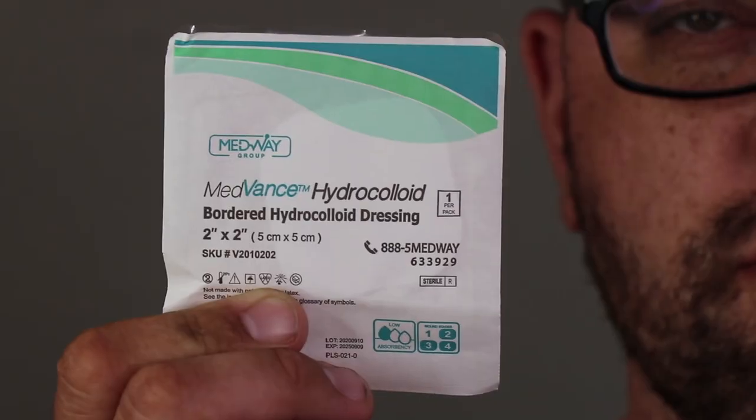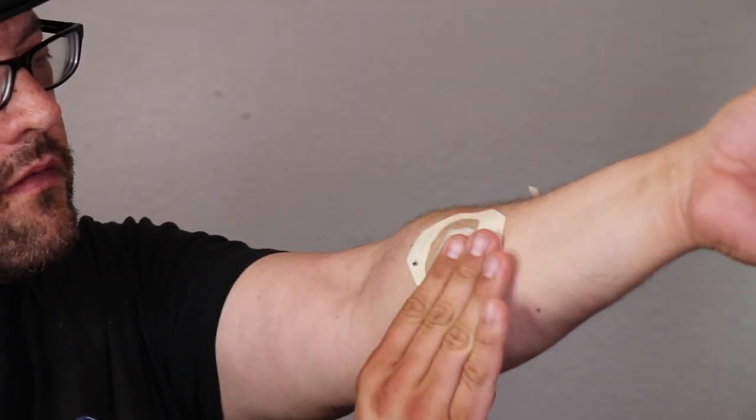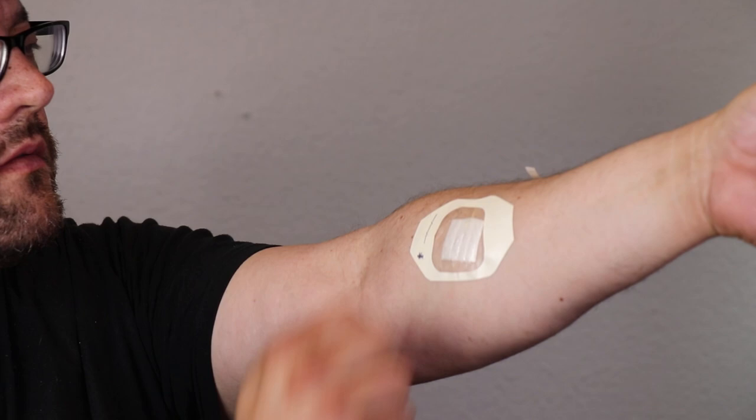The next item is a MedVance 2x2 bordered hydrocolloid dressing. It has a cohesive gel that's produced when it comes in contact with a wound to provide a moist wound healing environment. So for wounds, you want them not too dry and not too moist — you want to have them just right.